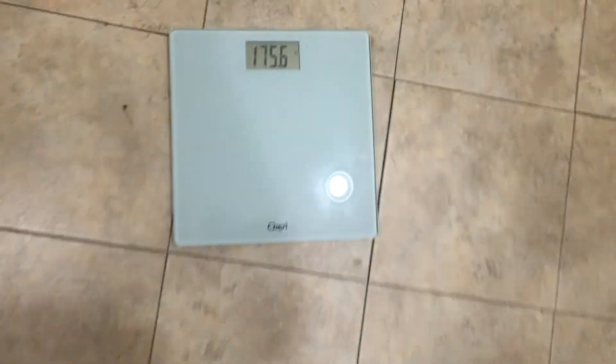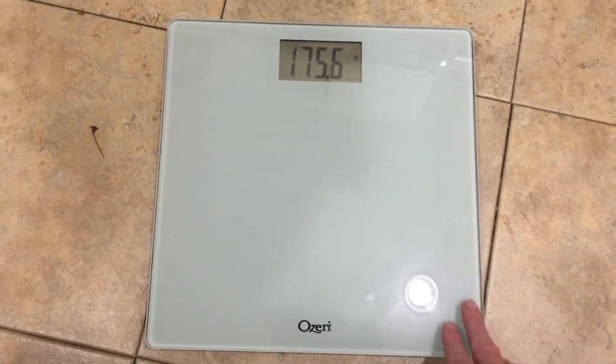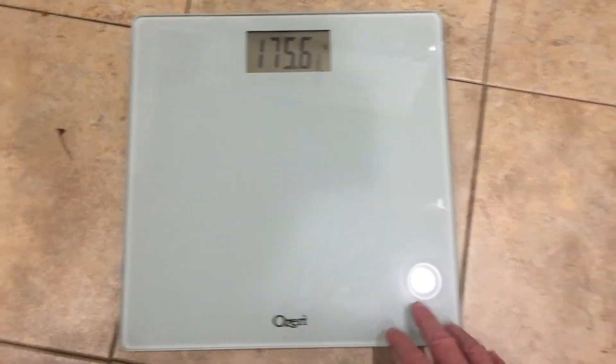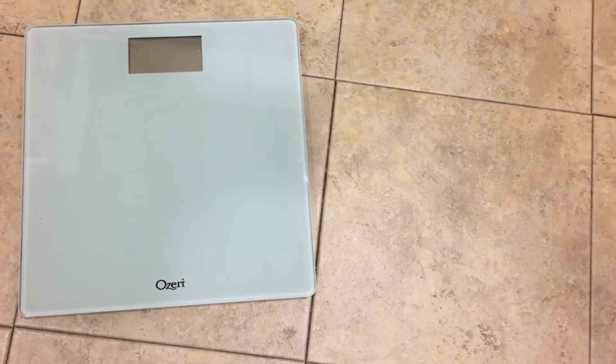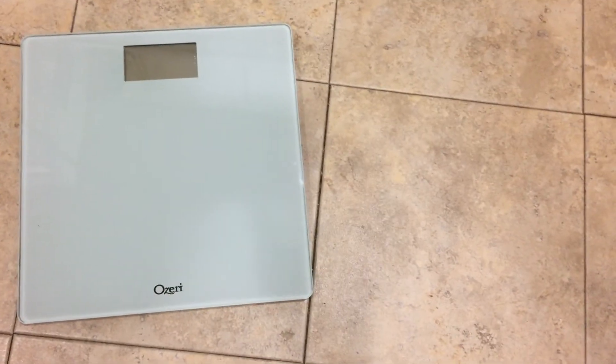Definitely nice design. I like that it's easy to clean and that it's just a flat surface. I've had other scales that were glass and you had to go around a rim to clean it. Nice design, functional scale — I like it. It's available for purchase on Amazon and that concludes my video review.